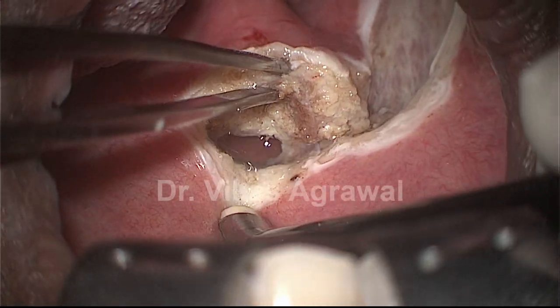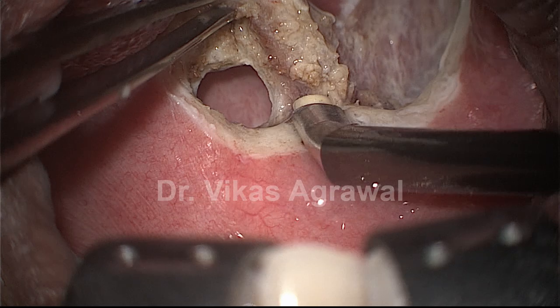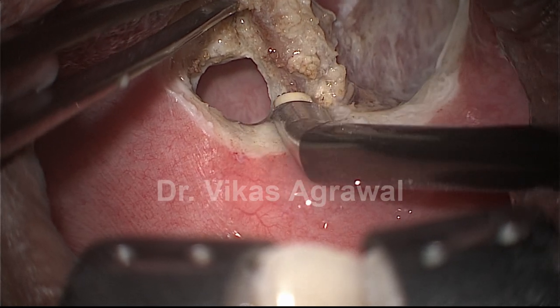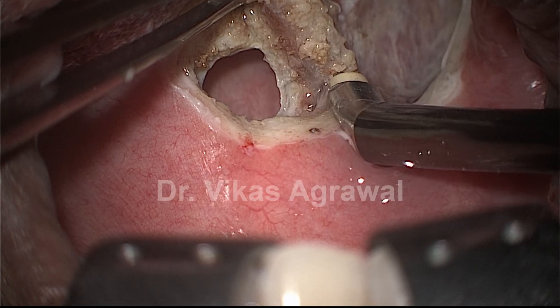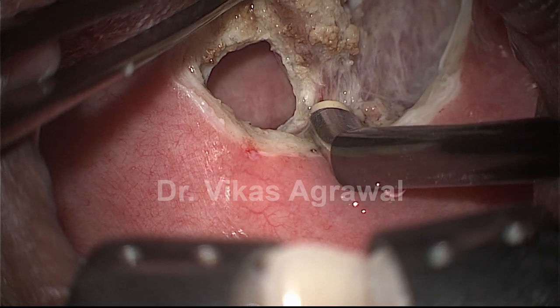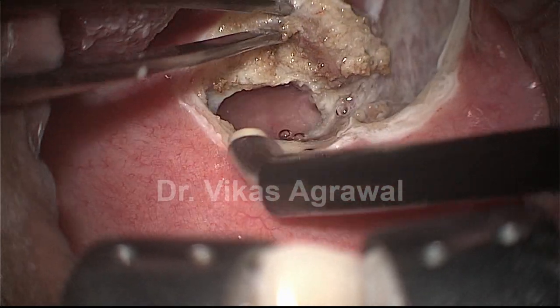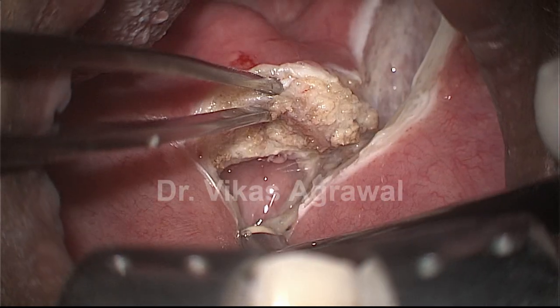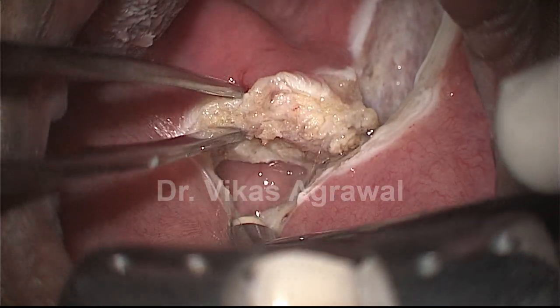Now we still know that we have sufficient length of the soft palate left behind. That is the length of the soft palate left behind which will prevent velopharyngeal insufficiency.